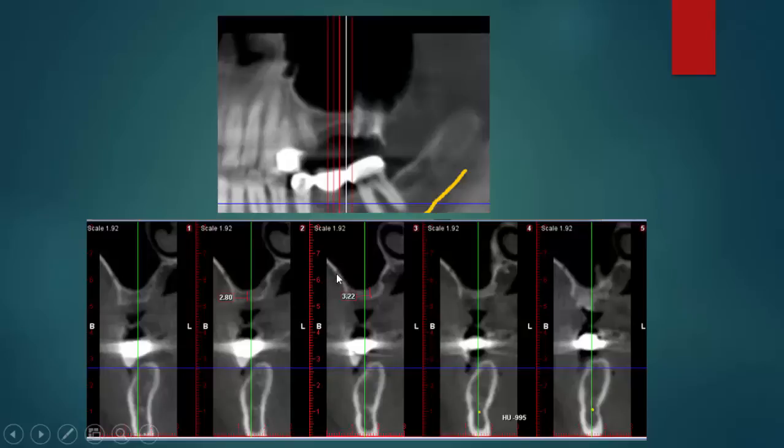This is the artery. This is what we talked about at the beginning of this lecture. This is the intraosseous branch of the posterior superior alveolar artery. ومثل ما ملاحظ location على artery is immediately into my window. So in order to avoid the possibility of the bleeding issue, I approach with a crestal sinus lift.